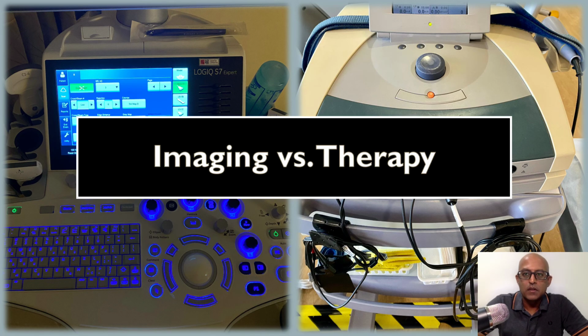Often patients ask me, what's the difference between therapeutic and imaging ultrasound? The therapeutic ultrasound is usually at much lower frequency, and the aim is to heat the tissue to have the therapeutic effect. Having had it done personally on pulled muscles and tendons, it's really quite a pleasant sensation. Imaging, on the other hand, is at a much higher frequency, and there's a lot more processing behind it to produce the images that we see on the screen.